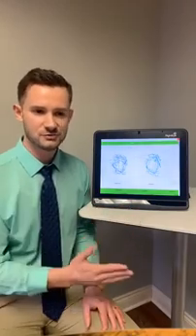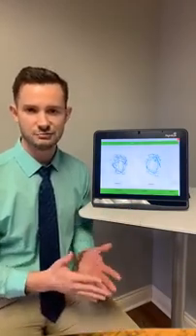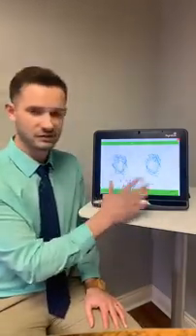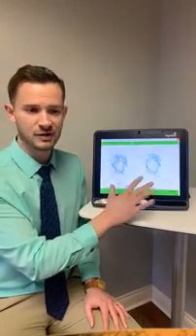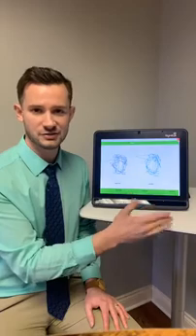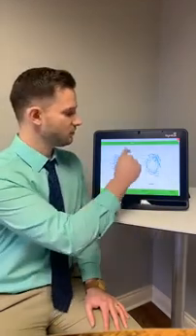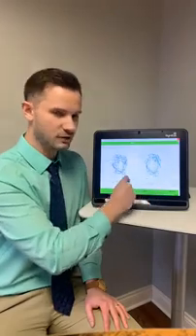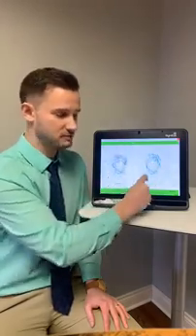The first one is called pursuits or tracking a moving target. And here we're doing circular pursuits. We can replay exactly where their eyes are pointing while they're trying to track that moving target. The first test, there's a dot moving in a circle around the screen about this big, about this speed.